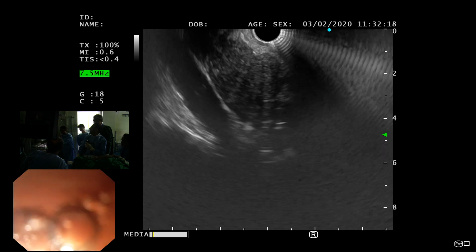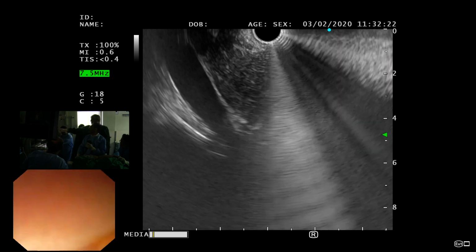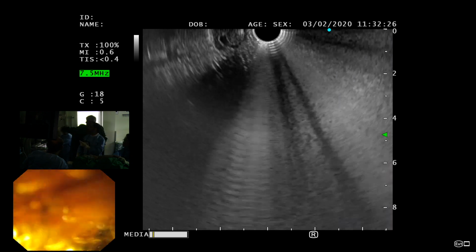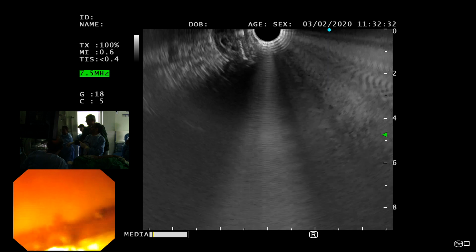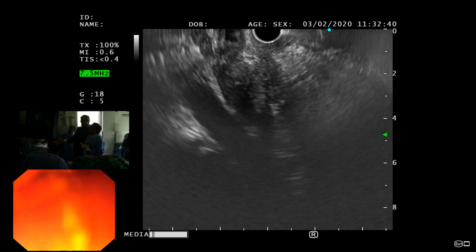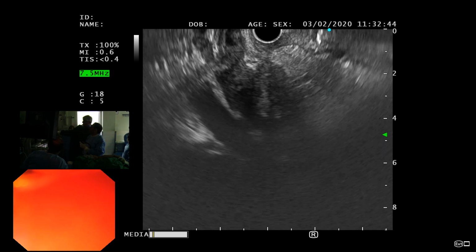थोड़ा सा एडवांस करें. So you just थोड़ा सा clockwise करें. You see that's the bile duct there. Those 2 lines are the stent. So still करना जरा still. नहीं still करें जरा image को. ये this is bile duct. You see there, हाँ. That's the stent. That is the stent in the CBD. You've got the stent there. जी. Now you need to take the air out, and you can follow this, bring it down all the way.